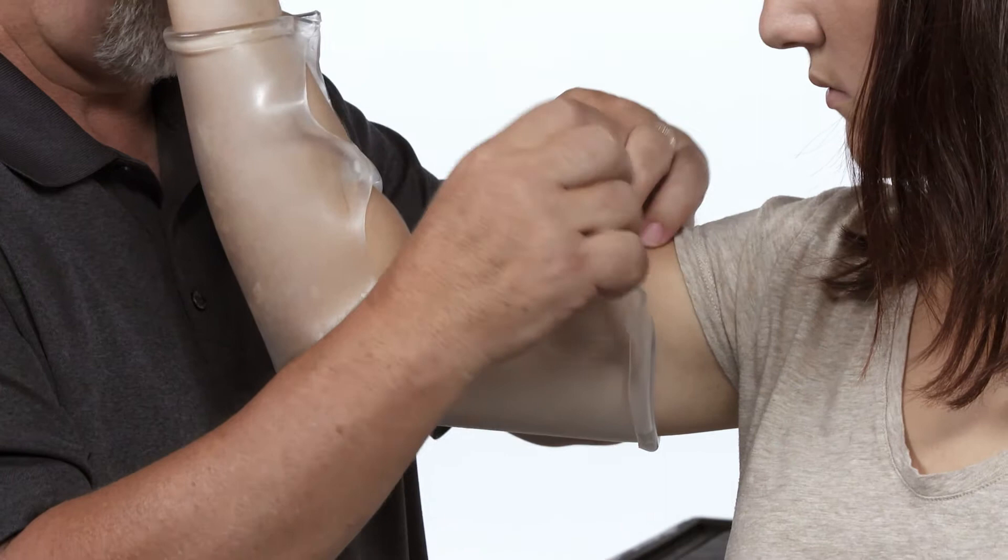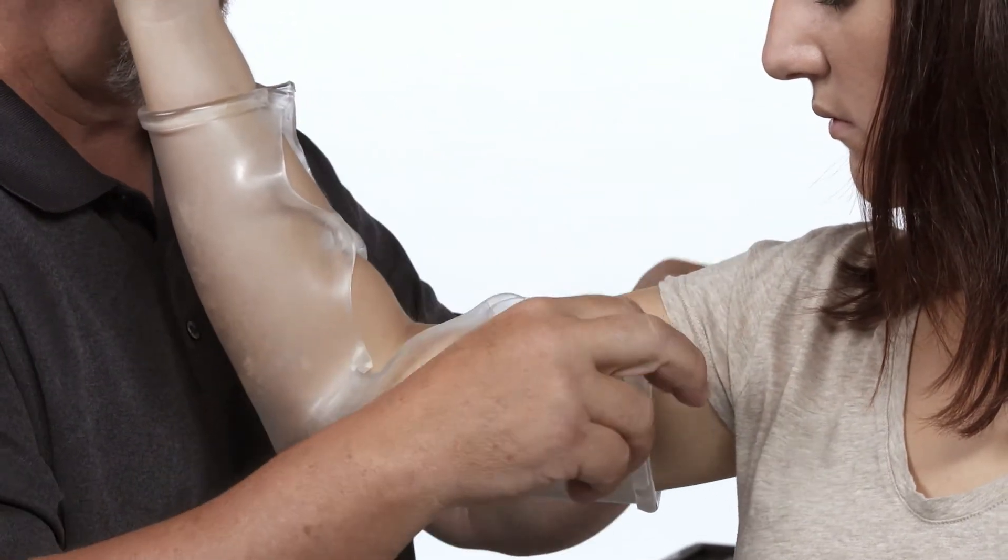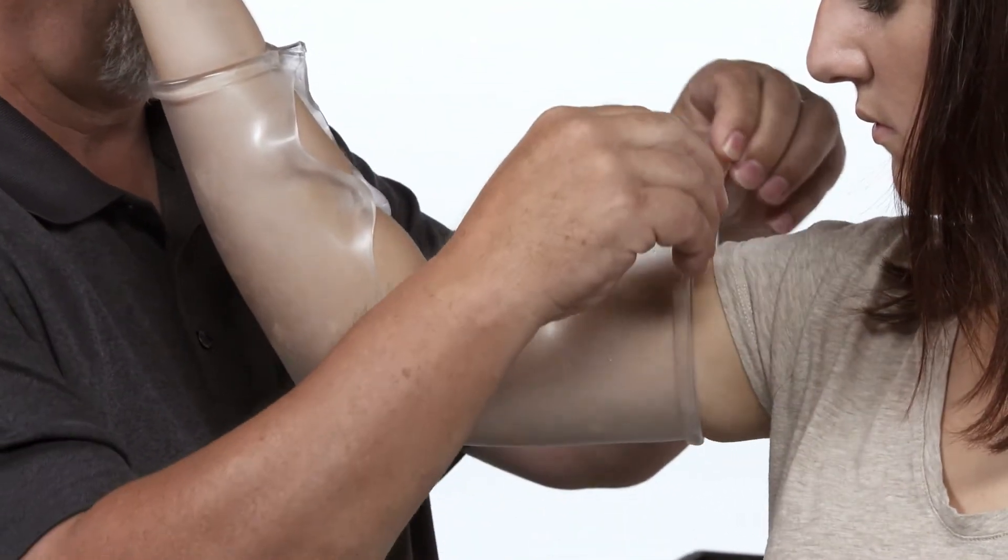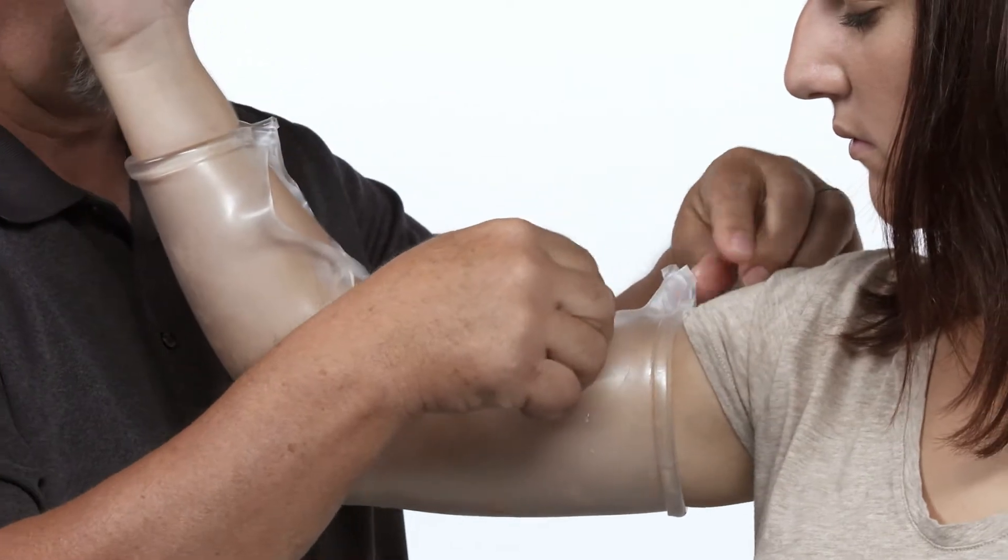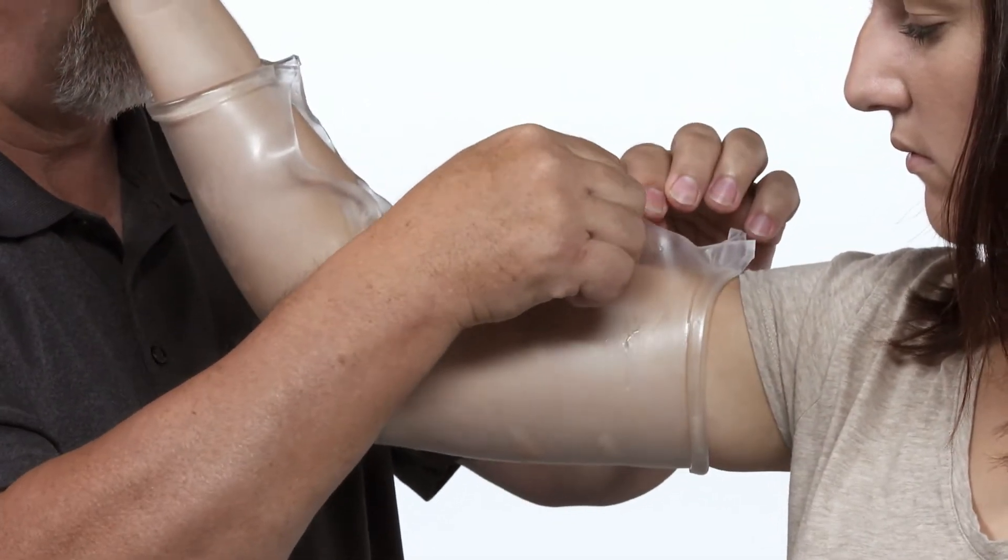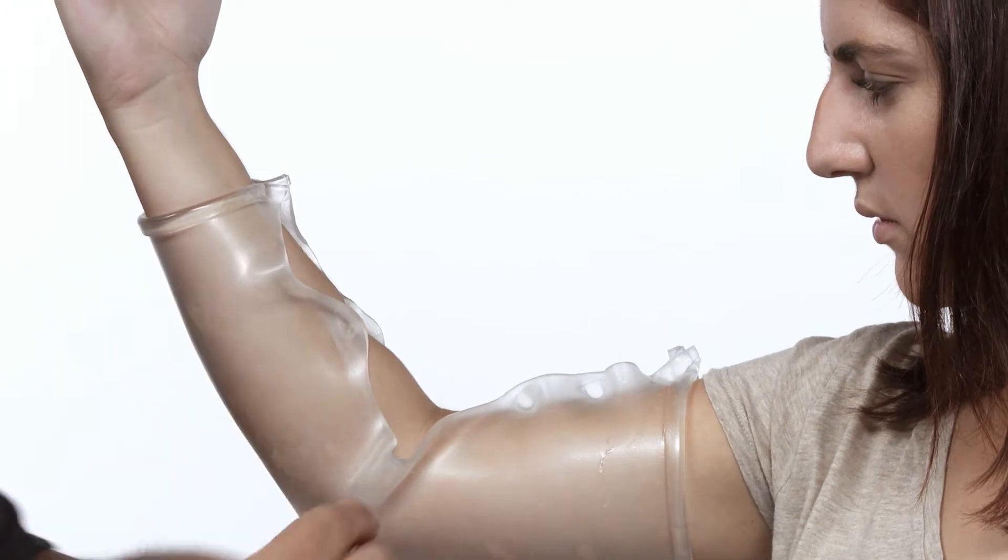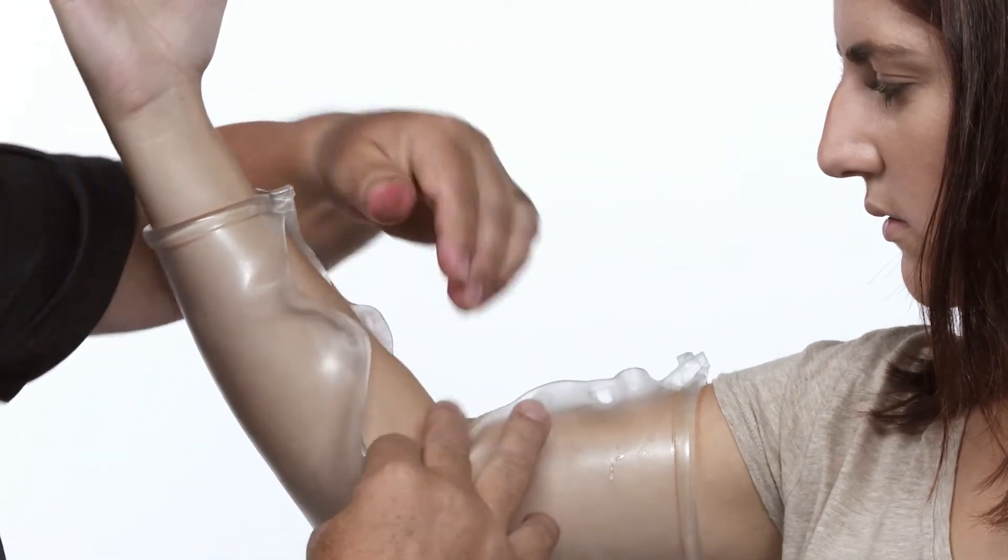Grasping the lateral borders just distal to the elbow, stretch the material around the underlying anatomy, pressing inside surface to inside surface to stick the borders together. Continue with this technique along the forearm to the upper arm.